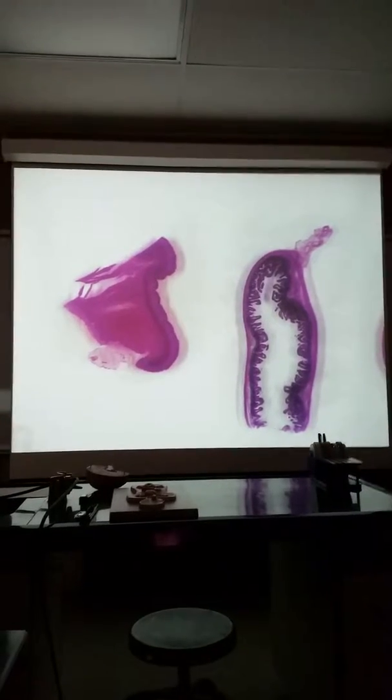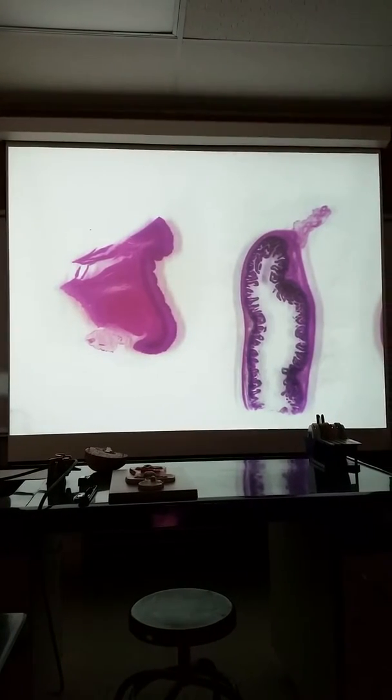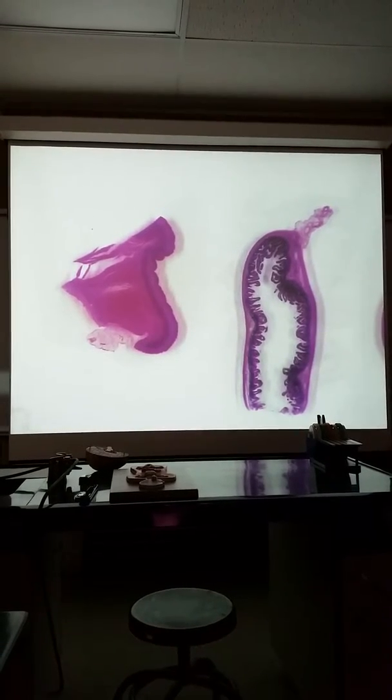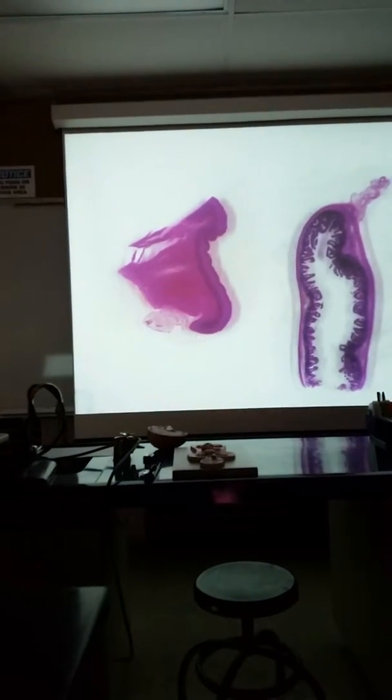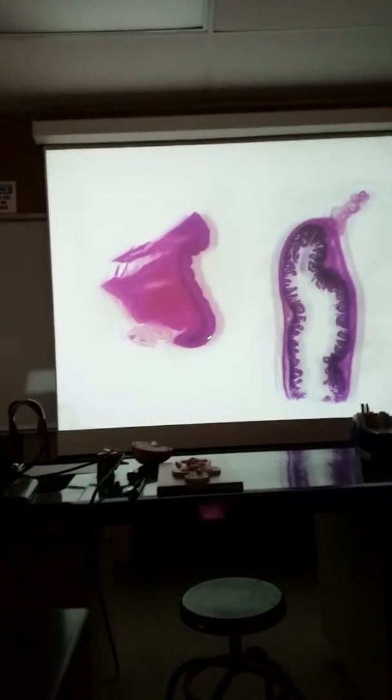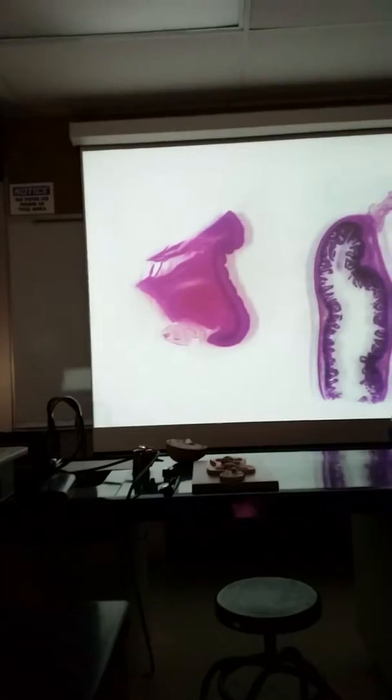tract. You have the mucosal layer, then you have the submucosa, you have a muscularis, and then a serosa layer. That's the outermost? Mucosa, no. Mucosa is the innermost. Yeah. Mucosa, that's in that lumen, the hollow portion of the organ. And then submucosa is approximately there.